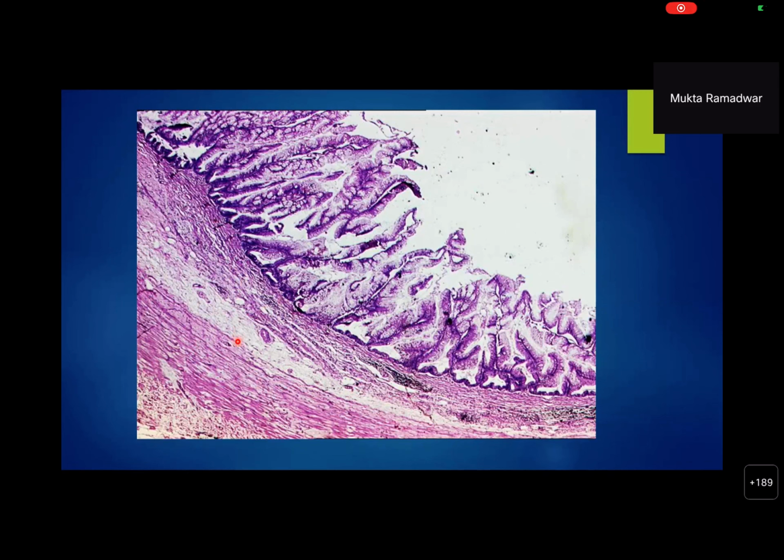Very, very good. So the submucosa is retained, it's not fibrous, and you are seeing this proliferation of glands, which are obviously not normal. They are showing abundant mucin within the cells. There is this serration, sawtooth appearance within the lumina. And then can you see this abnormal pattern? This boot-shaped pattern, horizontal growth pattern of these glands. Here also, these are so-called boot-shaped growth patterns, which are not seen in the normal gland, right?